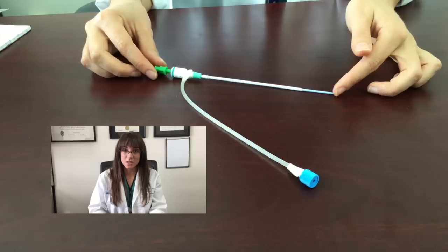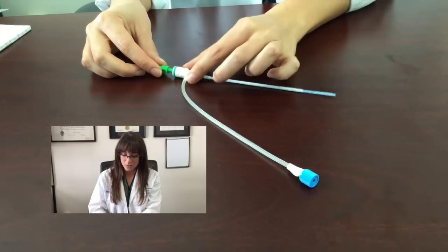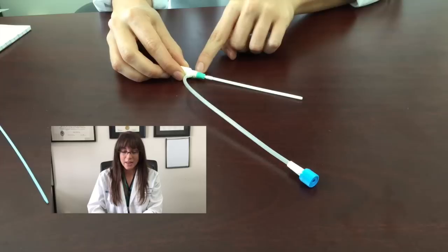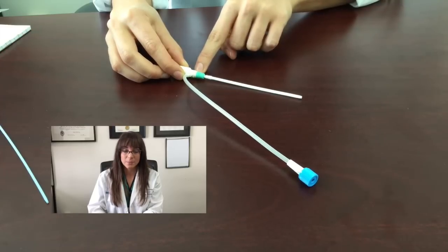For the purposes of this video, we are working under the assumption that you know how to place a cortis. This is the cortis that comes in the kit. Once it's correctly placed, you will take the dilator out and you will suture at the base pretty tightly to make sure that this does not move during the placement of the pacemaker.